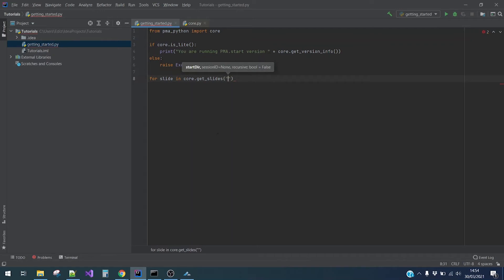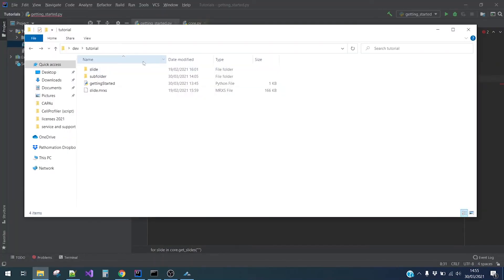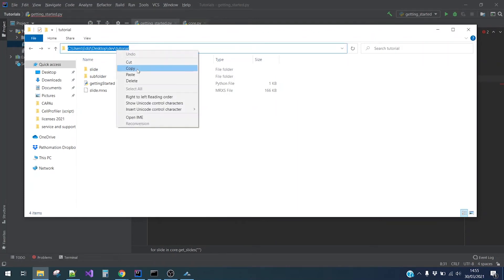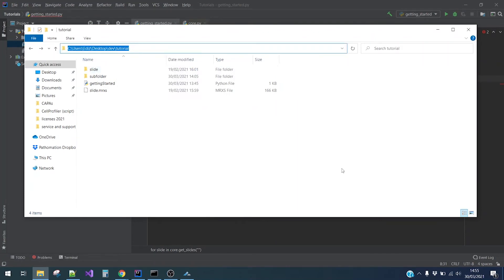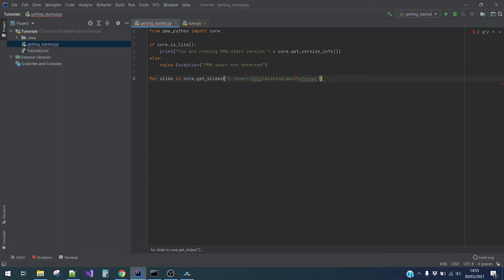Let me quickly copy and paste this. Here we go. And we will need to replace the backslashes with forward slashes. Make sure you do this.